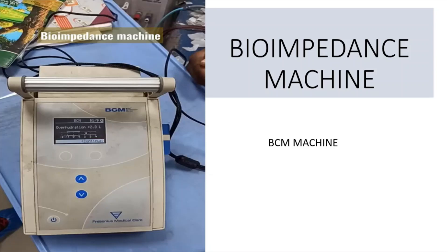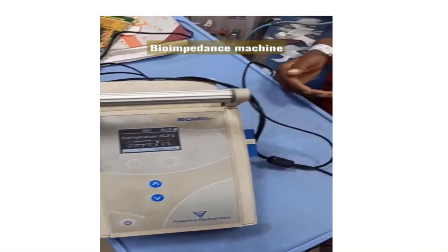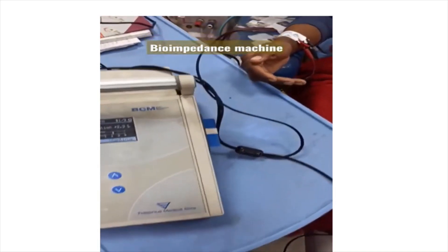Regarding the theoretical aspect of how this machine measures and gives the exact volume status, we will cover that in a separate video. In this video, I will show the practical usage and how to enter the parameters.